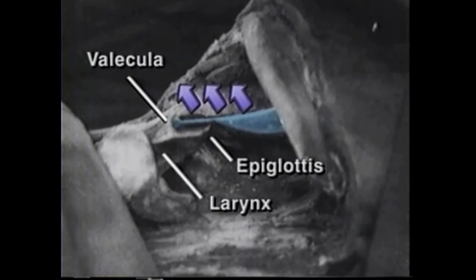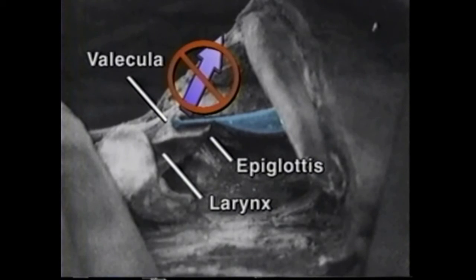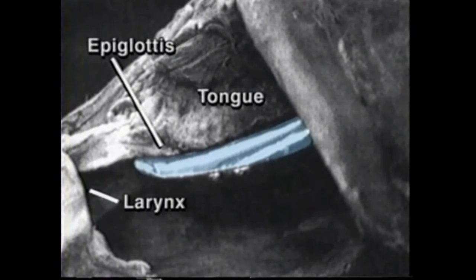Traction on the laryngoscope in the direction of the handle causes elevation of the epiglottis when the tip is correctly placed. Levering backwards on the handle of the laryngoscope can not only cause damage to the teeth, but also worsens the exposure of the larynx, because the tip of the curved blade is then not correctly applied to the vallecula. With the straight blade, the larynx is exposed by directly lifting the epiglottis. Straight blades are recommended in infants and small children, where the epiglottis is relatively large and floppy.